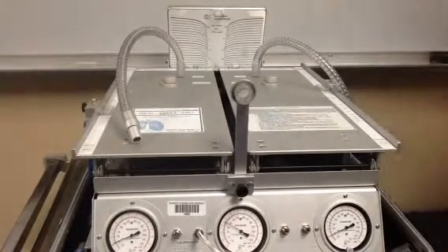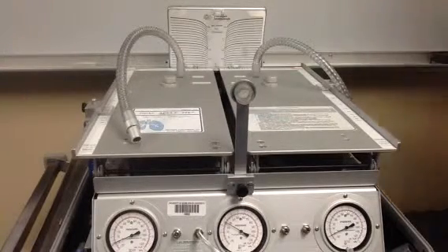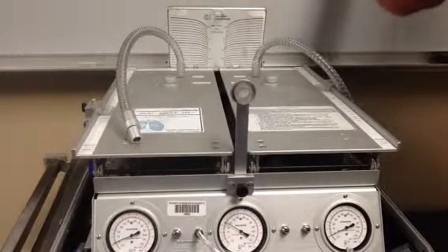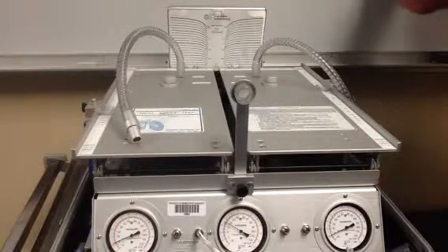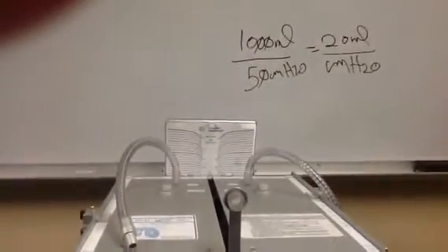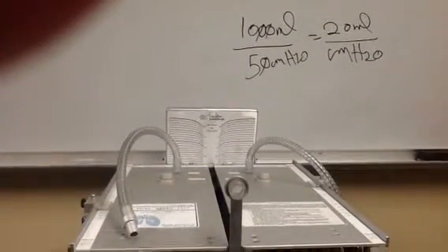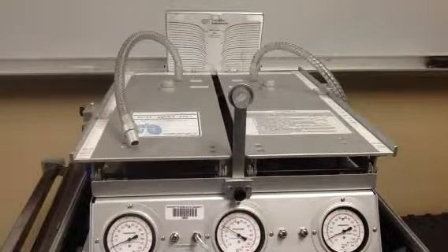And if you do the math on that, you're going to come up with a value for compliance, right? So let me see, if I do that, we're going to have a compliance value for that lung that is 20 milliliters per centimeter of water. So that's where I scratched out that math, and hopefully I did that right. Looks right to me. So we're going to compare that with the other lung.